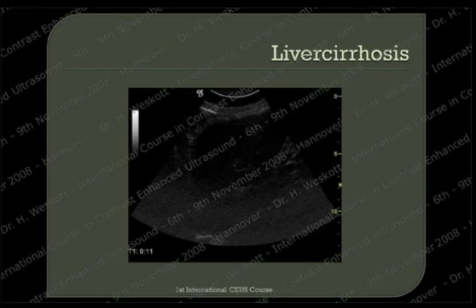And the last example is a patient with a liver cirrhosis. And just see, this is the portal vein. Here's the artery. And now you see the liver vein, and the liver vein fills prior to the filling of the portal vein. The portal vein is still unenhanced, and now you see the first bubbles appearing in the portal vein. So this is due to shunting. This is not an end-stage liver cirrhosis in this patient. This patient had a Child stage of 2 at that time. But you see the kinetics have totally changed in this patient.